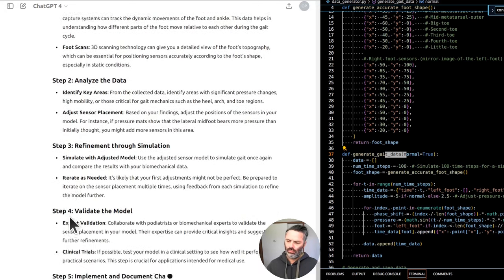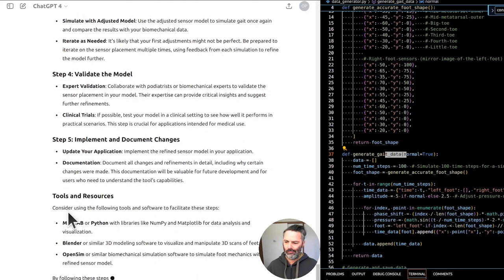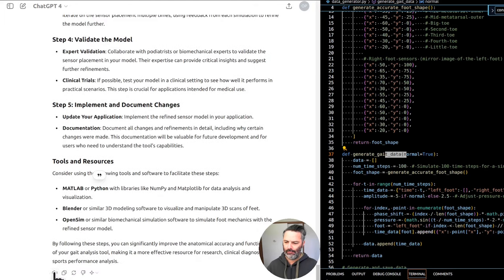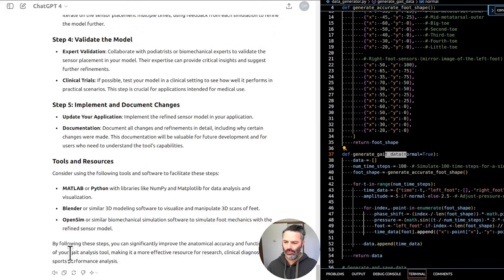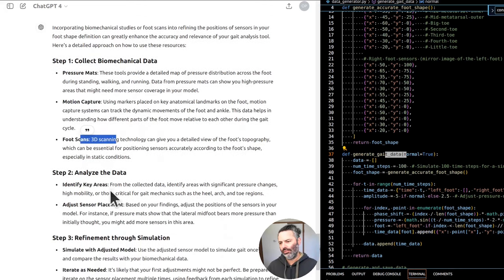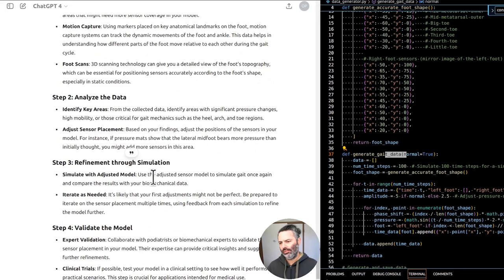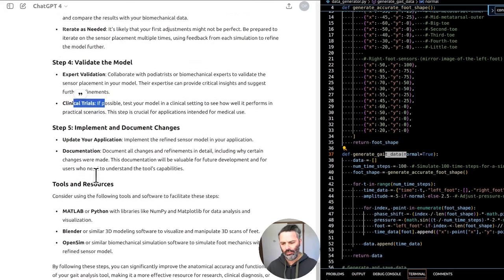Potential refinements. 1. Detailing and differentiation. More precise locations. While the script includes basic anatomical areas, adding more sensors around areas like the lateral and medial sides of the midfoot or more detailed toe differentiation could enhance the model's accuracy. Variable density. Different areas of the foot might require different densities of sensors to more accurately capture the nuances of pressure distribution, particularly in a biomechanical context. 2. Validation with real data. Testing against real measurements. To ensure realism, you could compare the simulated outputs with data collected from actual foot pressure measurements. Adjusting the model based on this comparison would help in refining the accuracy.